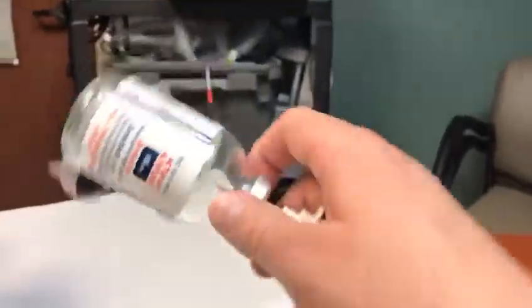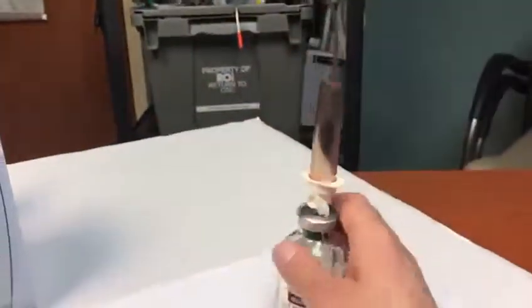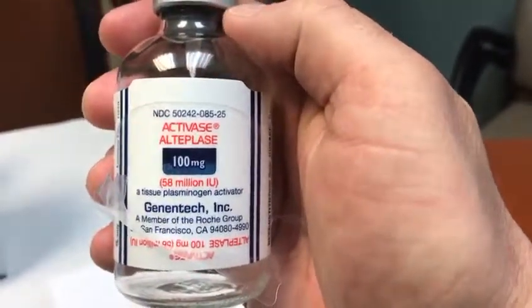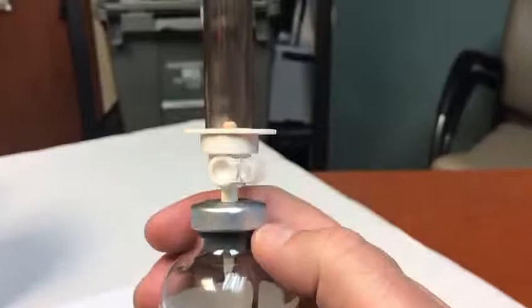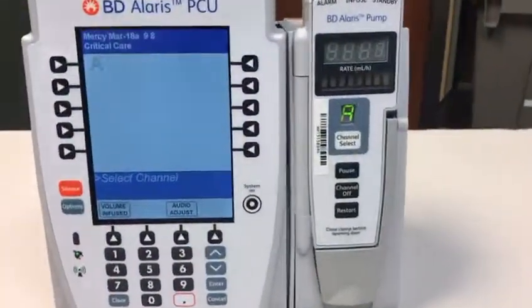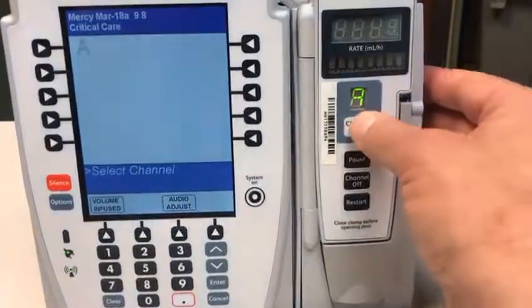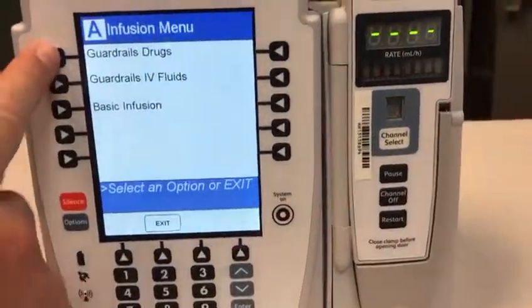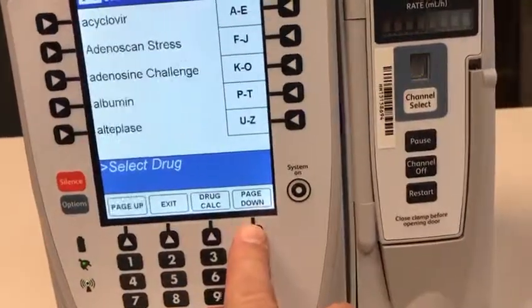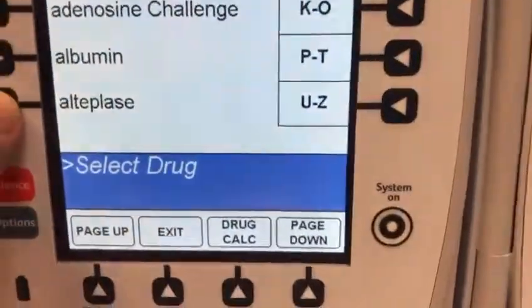So again, the pharmacist is going to provide this vial to you, 100 milligrams in 100 mils. It's going to be given over 2 hours. It is a dual verify, and we discussed how to properly spike it. So then we're going to come over here to our pump, and we're going to hit channel select. We're going to hit guardrail drugs. We're going to scroll down to alteplase, and we can see it right there on the menu.